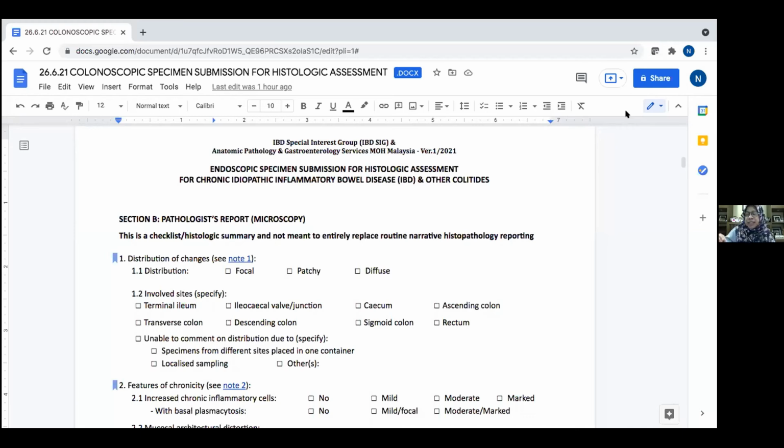Seeing eosinophils in the epithelium in the case of IBD is not considered as activity. So you don't base your activity on finding eosinophils in the epithelium. I rarely describe eosinophilic cryptitis unless I want to highlight a case of suspicious eosinophilic colitis, when there is really prominent eosinophilic cryptitis and crypt abscesses.